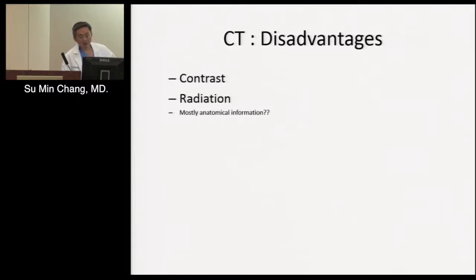In the old days, I used to put mostly anatomical information. Especially for coronary CTA, with the advent of FFR-CT, we can now extract a lot of functional information from the coronary standpoint. And with flow modeling, in the future you can probably even get some functional information about cardiac function.